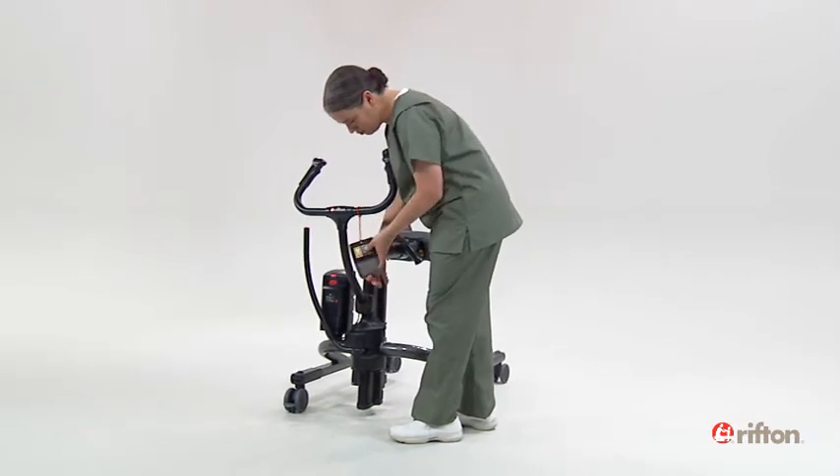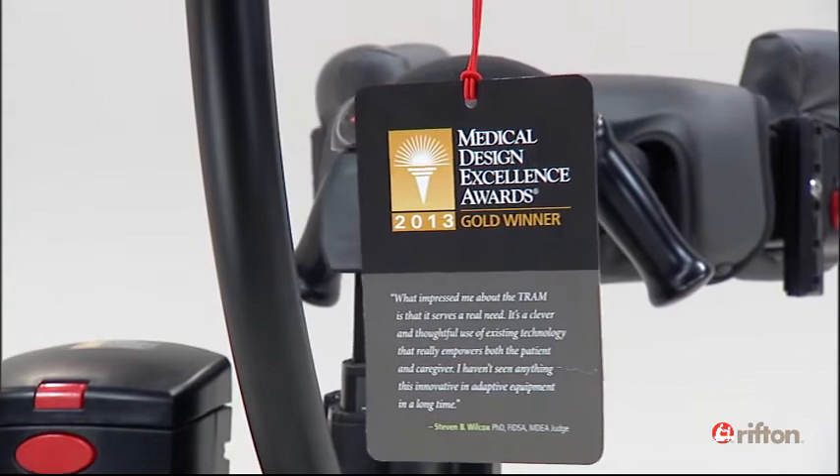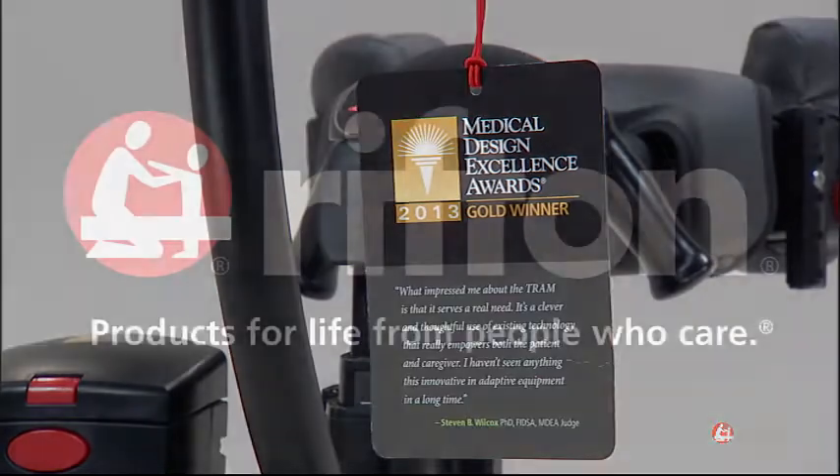The Riften Tram. Award-winning design to help you lift, transfer, and ambulate your clients safely.